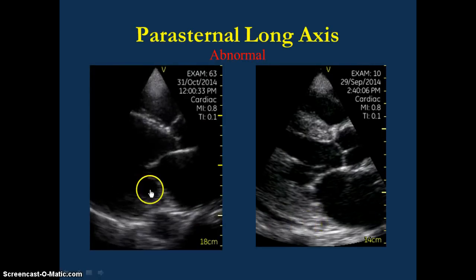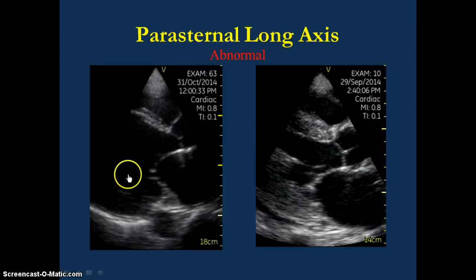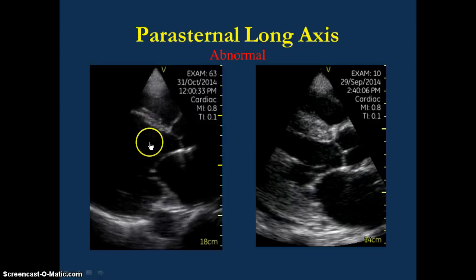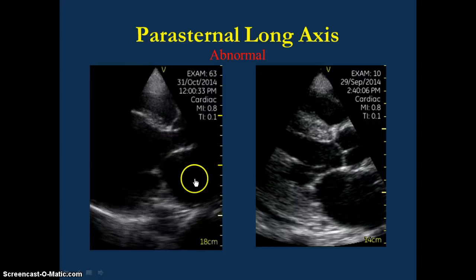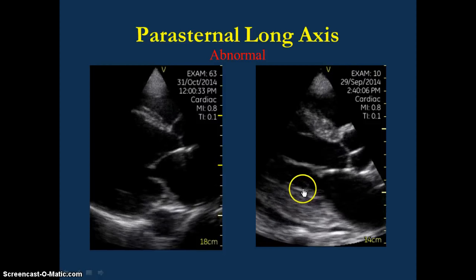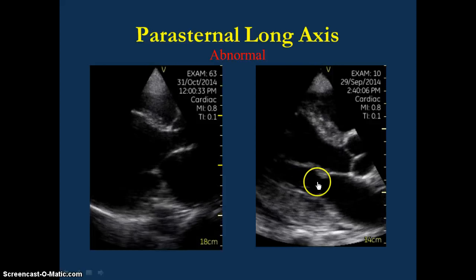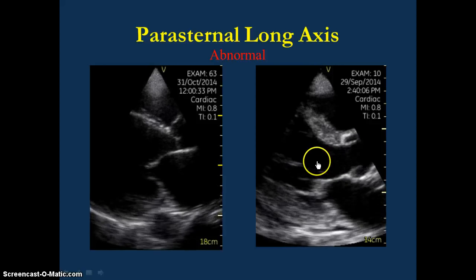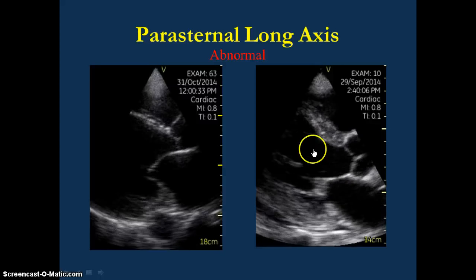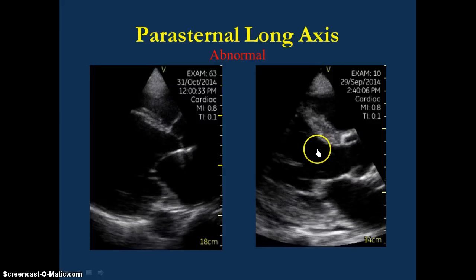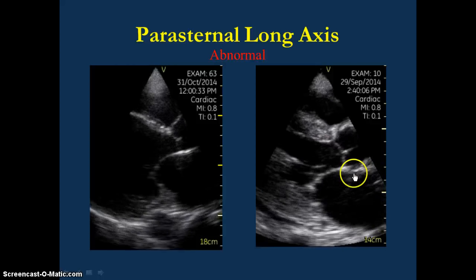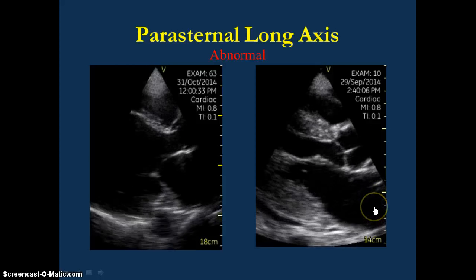Here's an example of a dilated cardiomyopathy — you can see the mitral valve is not coming anywhere near that interventricular septum, and the left atrium is very enlarged. Here, you might be inclined to say the function is normal because they're beating quickly, but if you pay attention closely, you can see this is definitely not coming within one centimeter, and the left atrial AP diameter is quite large.